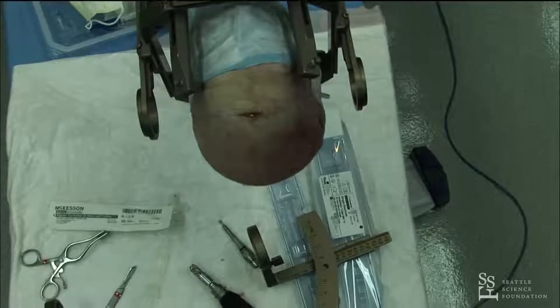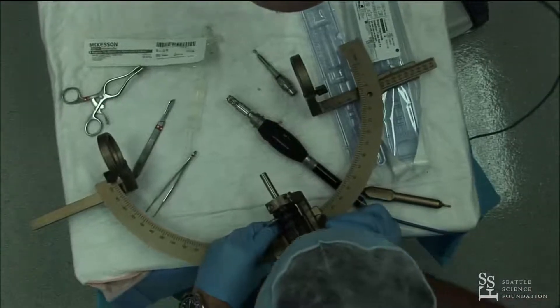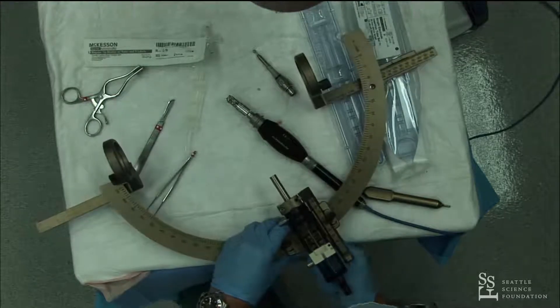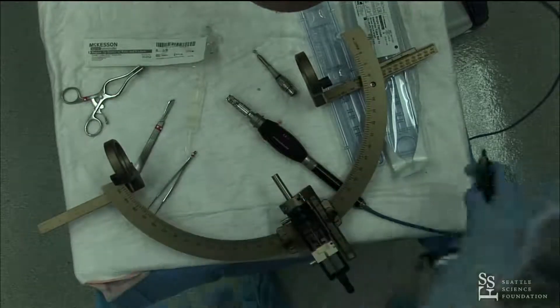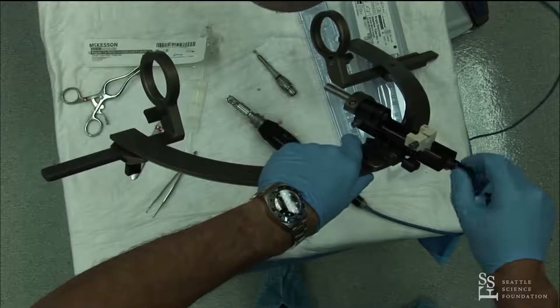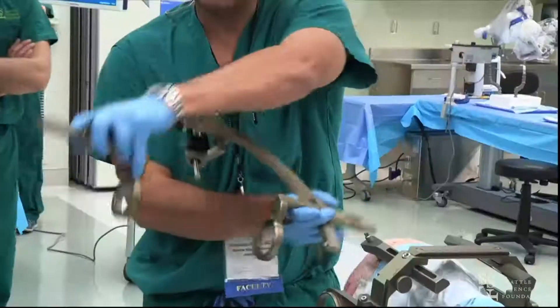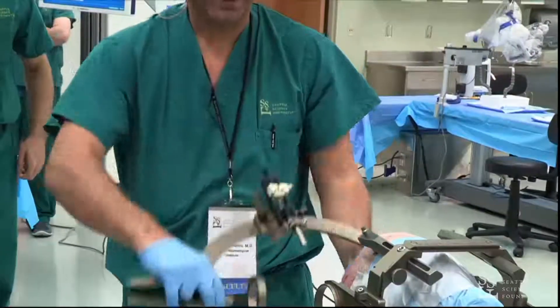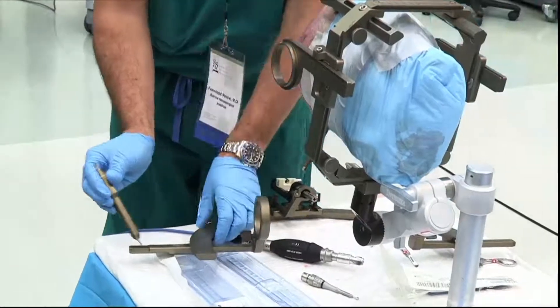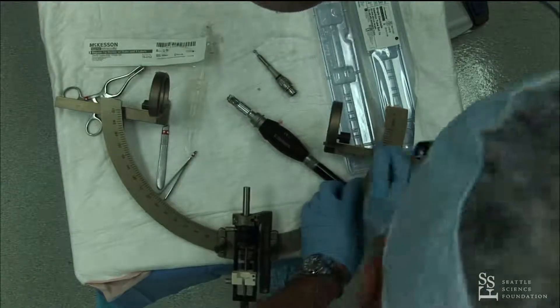Our arc — this is a semicircle — is 82.3. And our X — this is one of those things that's good to be comfortable with a particular system. The Leksell frame is actually made so you can orient it in multiple ways, and depending on how you orient it, you've got to pick the right Y or X, and the right set of numbers up or down. So this is a lot to keep track of. And the X is 84.2.